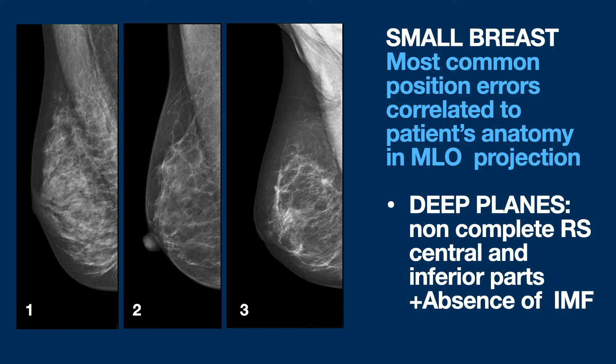The first error I would address is the difficulty in showing the deep planes — in this case we are undoubtedly talking about the central and lower tissue, as you can see here — to which is added the absence of the IMF.